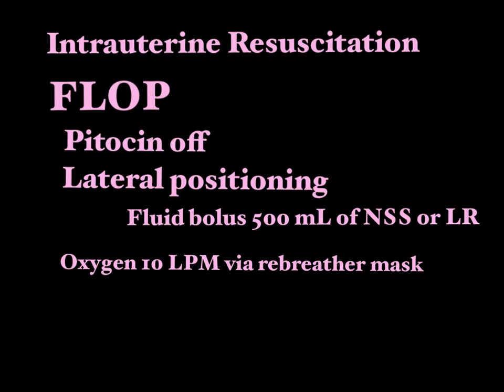Because the baby's always a little less oxygenated than mom is. So if we hyperoxygenate mom, we'll get baby just a little bit more reserve. So that's intrauterine resuscitation. Now, you notice I have the pit off. When we get to labor, we're going to talk about how we manage Pitocin. Now, if you were using Pitocin because your labor wasn't adequate, you have to wonder what's going to happen. When you turn the pit off and you don't have adequate labor, mom can't make progress, the baby can't tolerate labor. Maybe we can get the baby to recover, and maybe we can't.